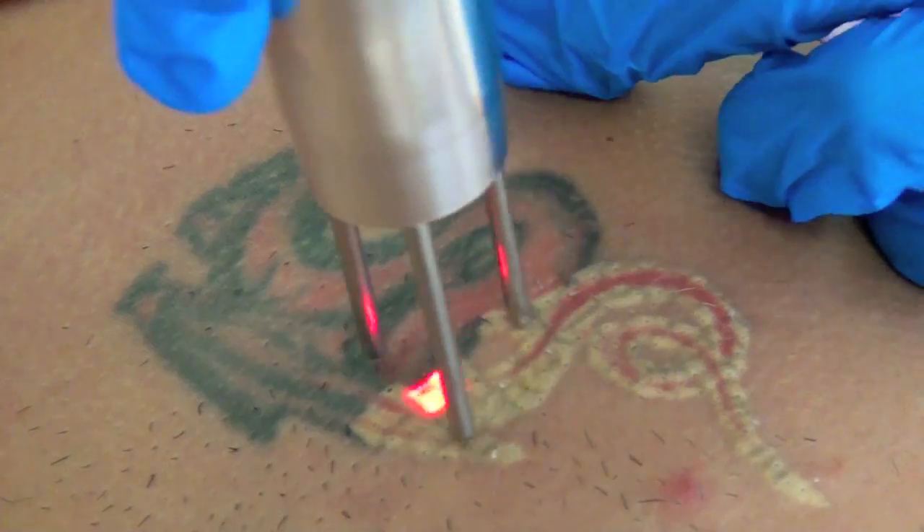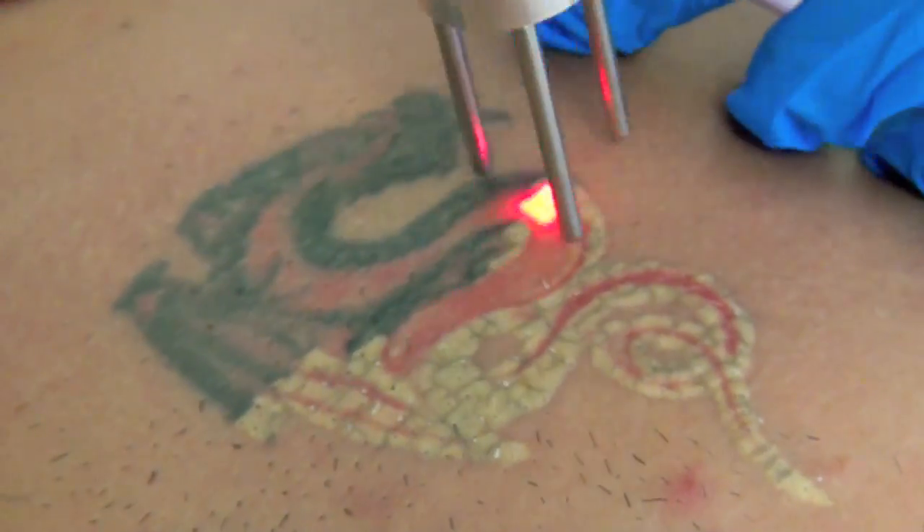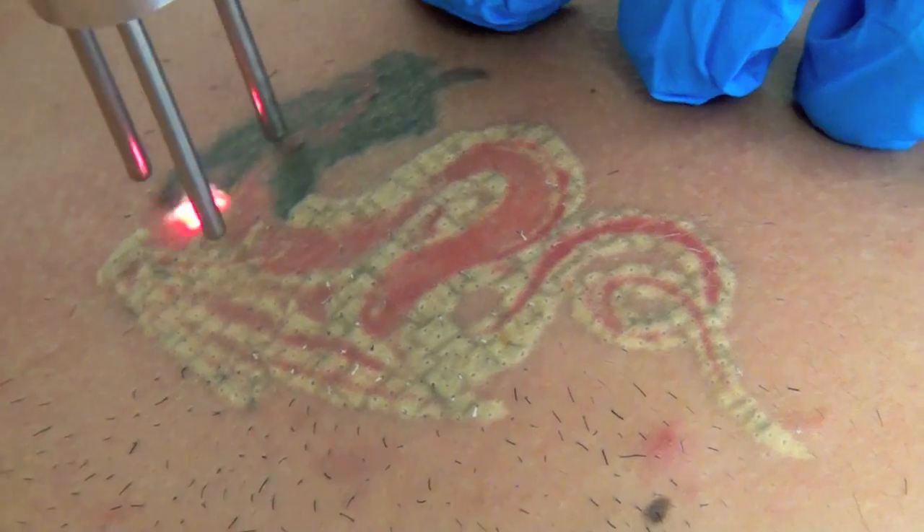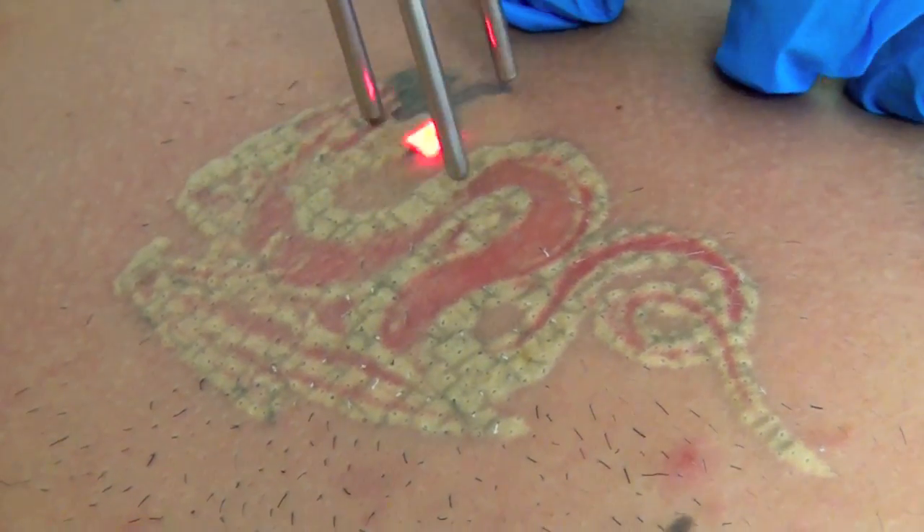The playback of this two-minute procedure is also accelerated for your convenience. Right now, the Duality's 1064 nanometer wavelength is being selectively absorbed by the black ink in the tattoo.